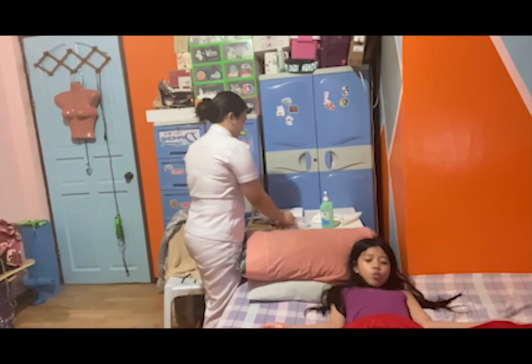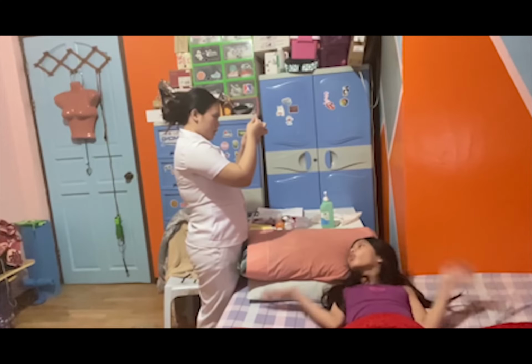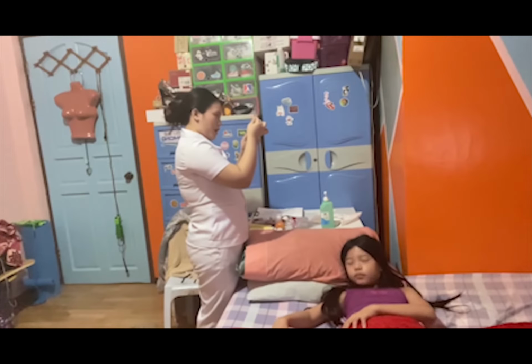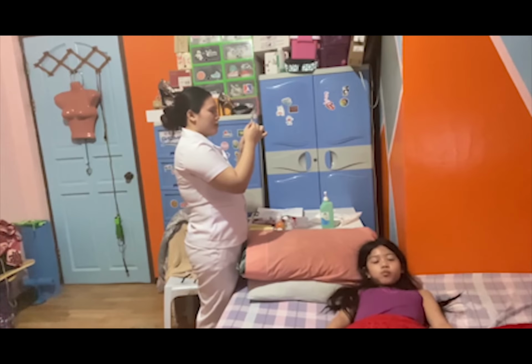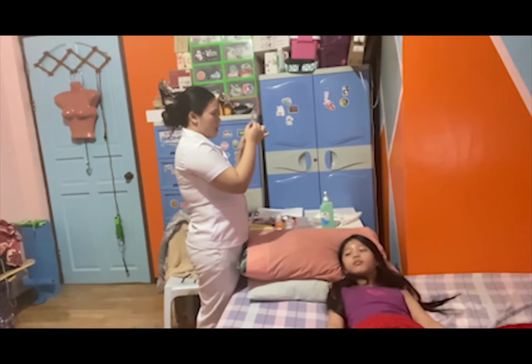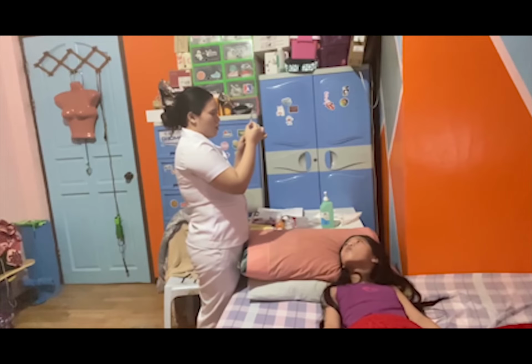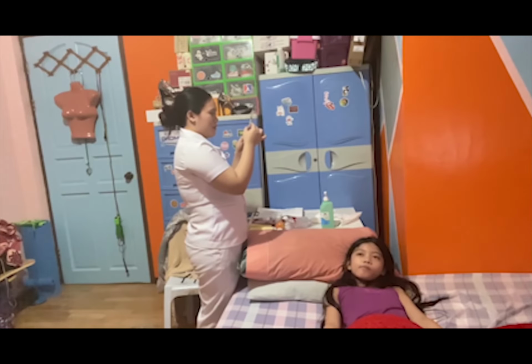Then pull the plunger back. This is used for knowing how many ml of the medication will be used, how many milliliters.